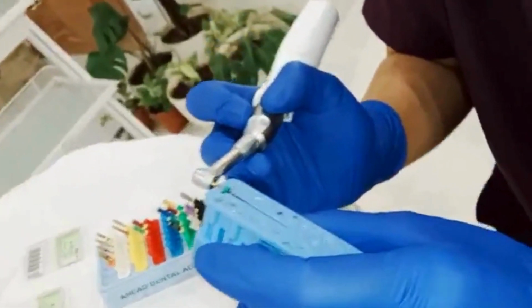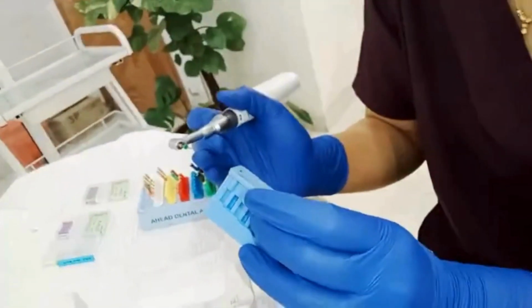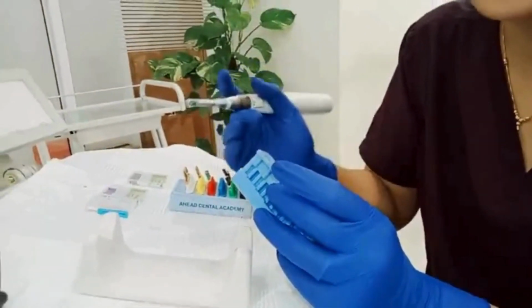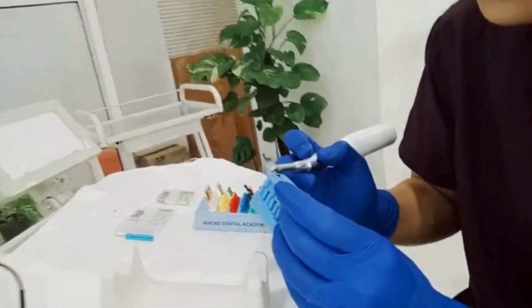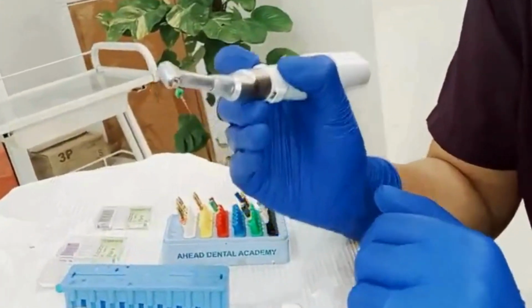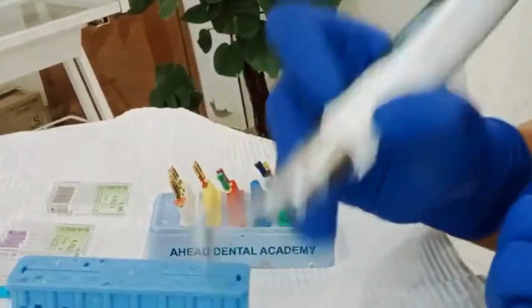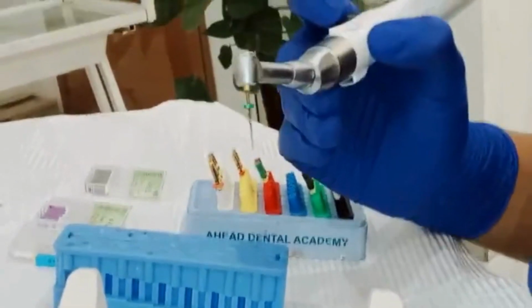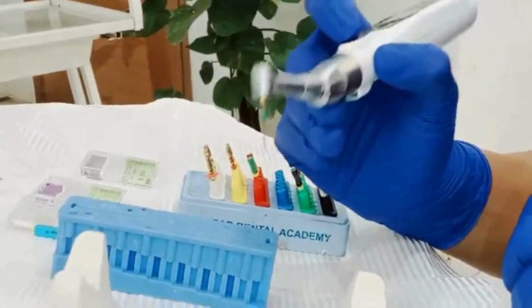As I have seen in my diagnostic X-ray, I have seen there how much can be the working length with an idea, and then I'll be checking it for 15 mm. Then I'll be using orifice opener to open up the orifices which I have found from the DG16 and my 10K number file. So this way it works, and it will go like this. Inside the canal it will go like this.